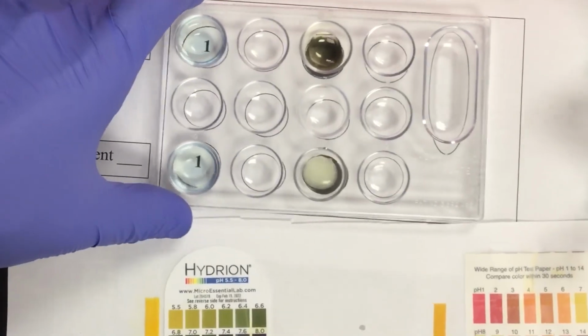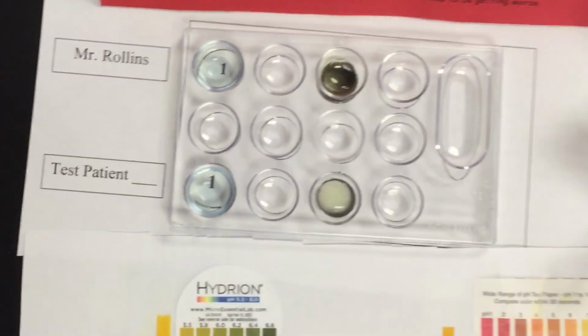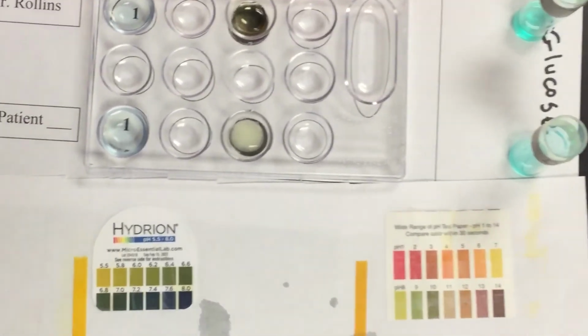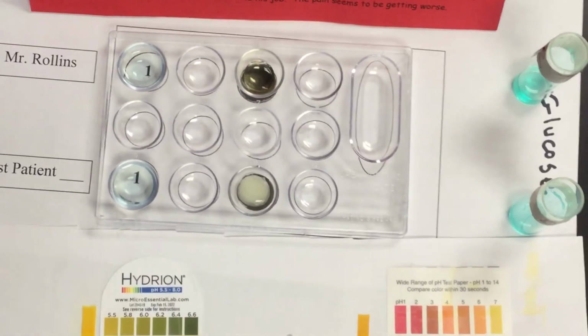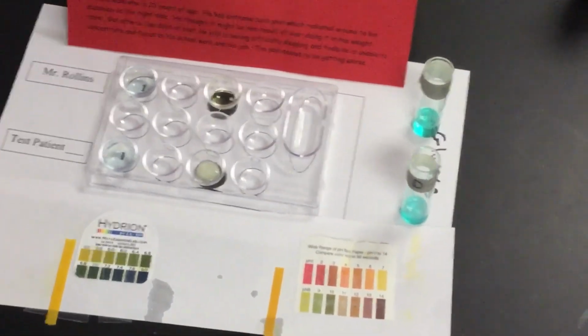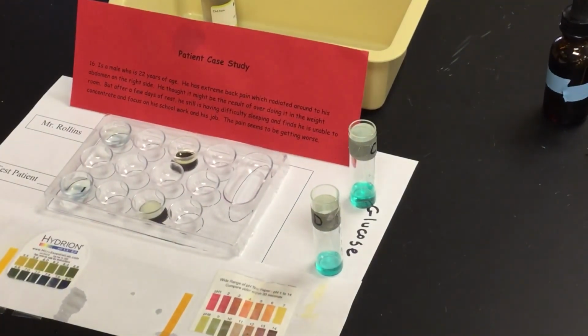For your chlorides test, Rollins is clear up here. You're going to notice patient number 16 has kind of a milky substance in it. With chlorides, if it is positive, you will get a white precipitate that forms, and there's actually kind of a chunkiness in the bottom of that. The only other thing you have left is to look at the microscopic view on the computer and come up with your analysis of what you believe patient number 16 has.